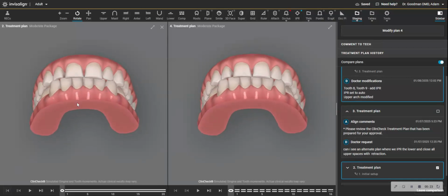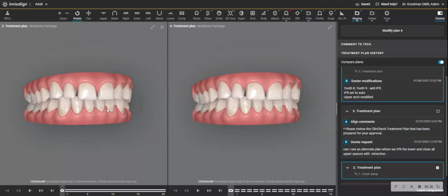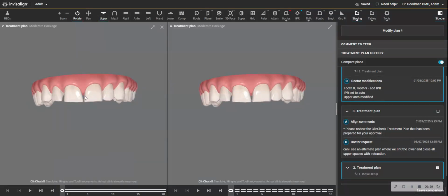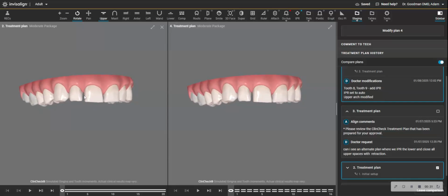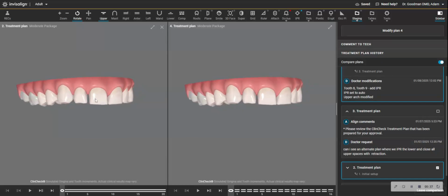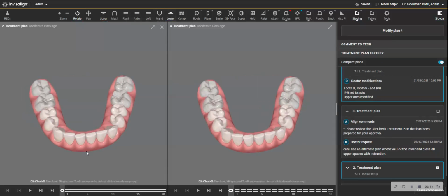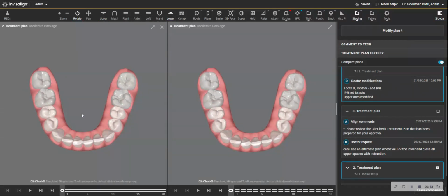Okay, so this is the same mouth, but if you look at the left, we have some minor spacing. This is the patient's main concern. We have a smaller space here, more of a dark triangle with a little space here, but we have about a millimeter space here. Now, compounded with that, we have some moderate lower crowding, minor to moderate lower crowding.